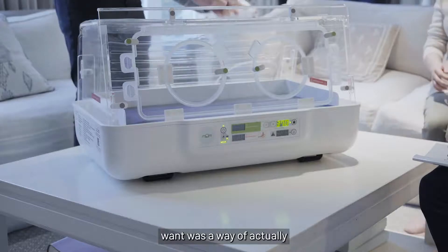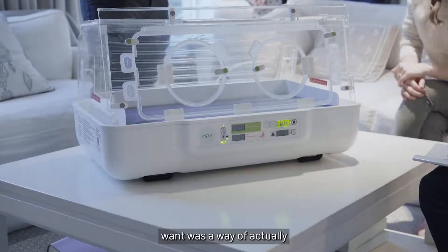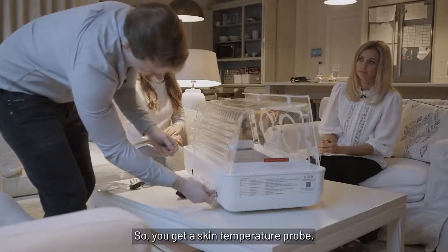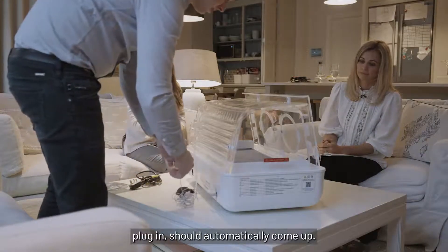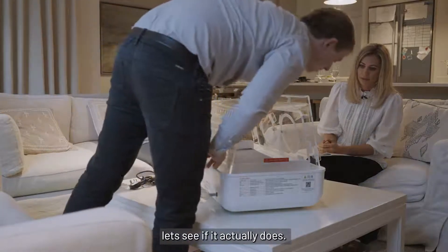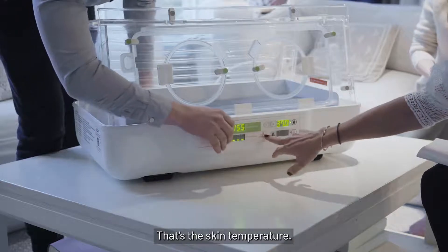One thing doctors did want was a way of actually telling what the child's temperature was. So you can get a skin temperature probe, plug it in, and it should automatically come up. It doesn't register until it's about 20 odd degrees — but that's the temperature in there, that's the skin temperature.